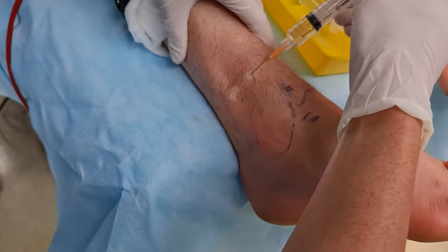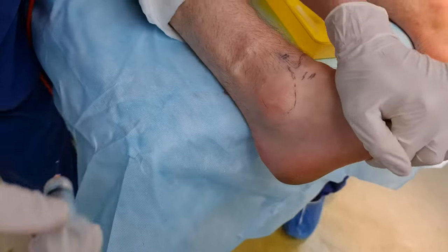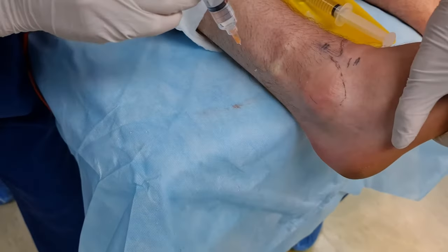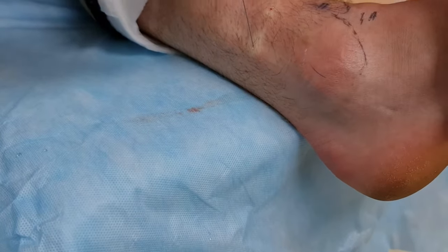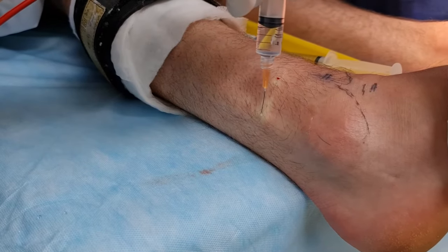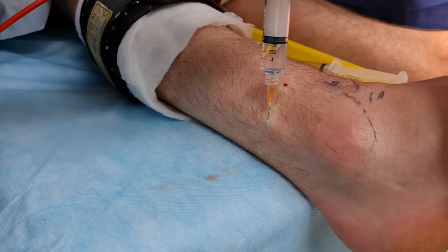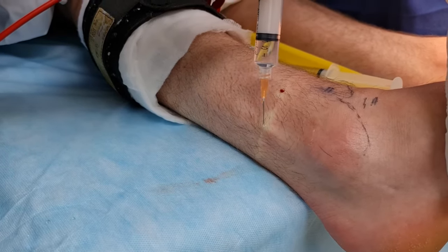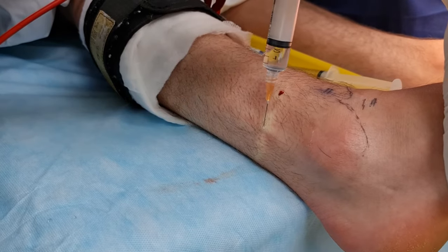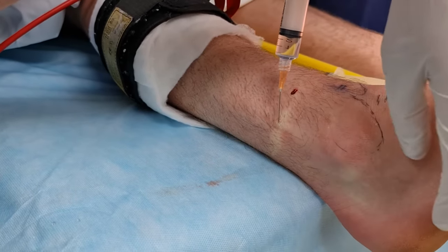The last bit is your sural. Sural is also superficial. You can see where that bleb finishes — basically go to where the Achilles tendon starts, stay superficial as well. You can fan out a little bit. If you're this proximal, you don't have to fan as much as if you're injecting further down near the malleolus.